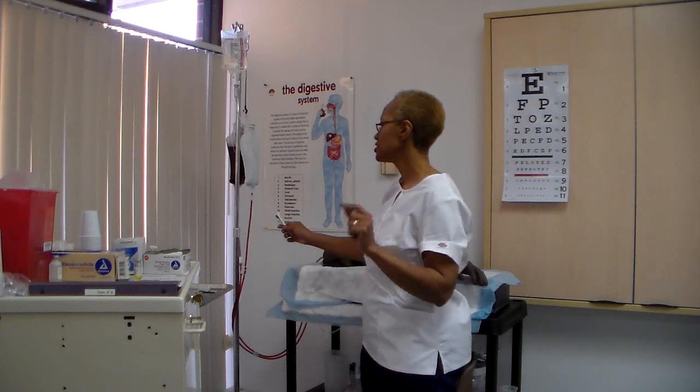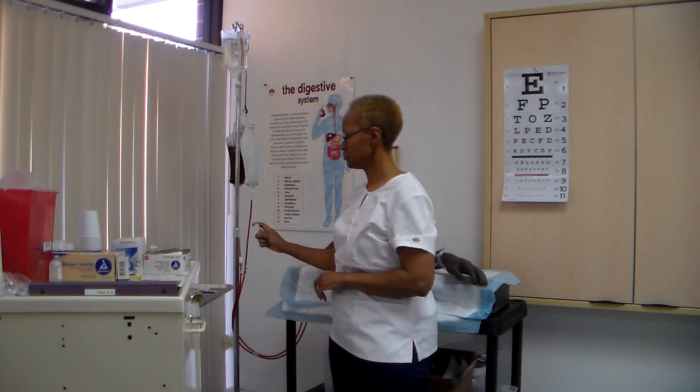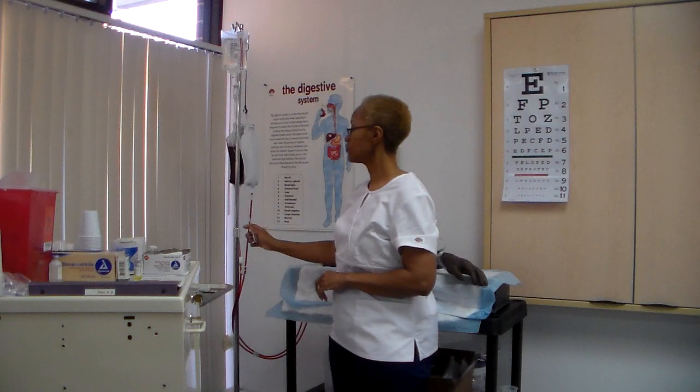Okay, so what the skill is telling you is that if you're going to be adding medication to this bag, you need to close off your clamp. You need to identify how much solution is in that bag. Take the bag down, add it to the bag, invert it back and forth, make sure you mix it properly, completely, and then hang your bag back up. Okay? Complete medication label and apply it to bag or bottle. Regulate infusion to desired rate. Use IV pump if indicated. Okay, so I would be either counting drops or I would be hooking it to my pump.